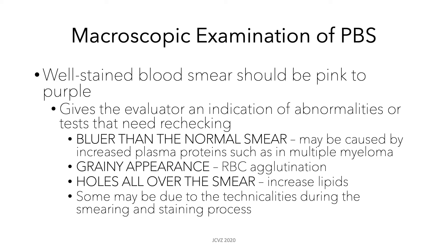Let's go into more detail about the macroscopic examination of peripheral blood smears. Your stain should be pink to purple, and the color of your stain can give the evaluator an indication of any abnormalities that may be present or tests that need rechecking. For example, if you notice that your stain is bluer than normal, this may be caused by an increase in plasma proteins due to diseases such as multiple myeloma. A grainy appearance could mean increased RBC agglutination, and if you see holes all over the smear, this may be caused by increased lipids.